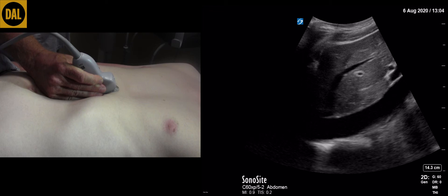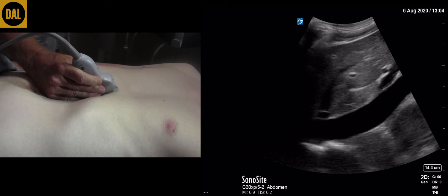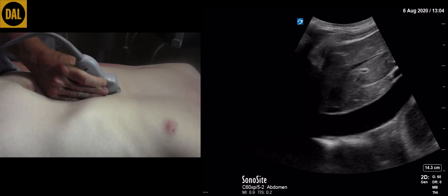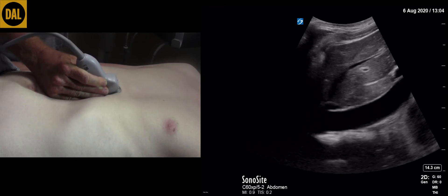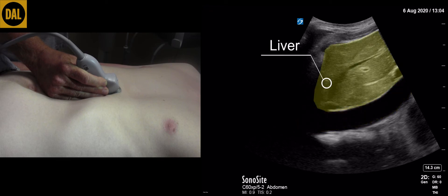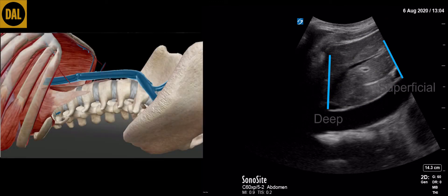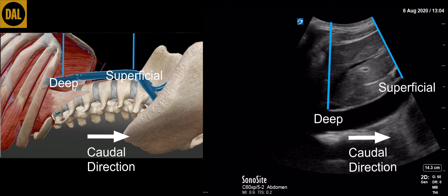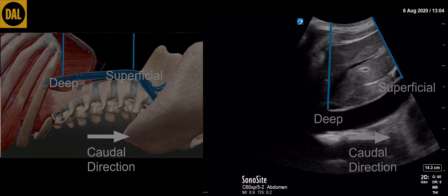Then in order to visualize the IVC, tilt the transducer to the patient's right until the IVC comes into view. The IVC is situated just deep to the liver in its long axis, becoming more superficial as it tracks cranially. The transducer may need to be slightly rotated in order to visualize the entire length of the IVC on the screen.